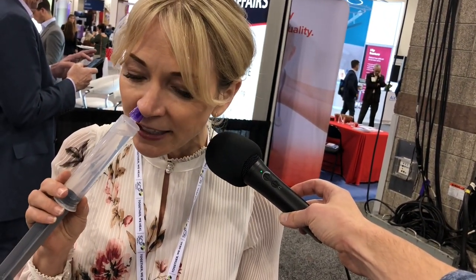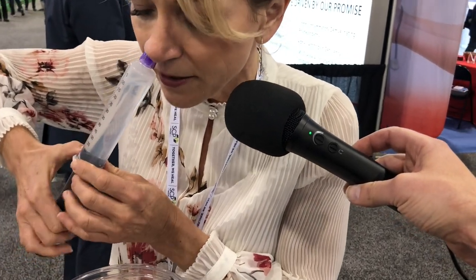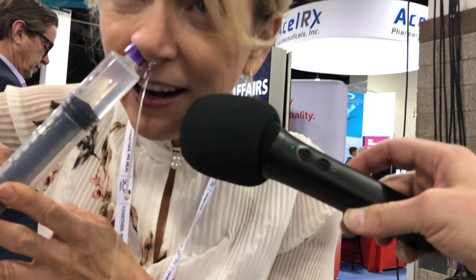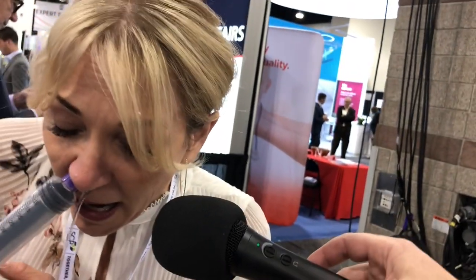The biggest concern people have with using the schnozzle is that they're going to drown a patient. So you're going to first insert the schnozzle — this is for adult patients — into the nose and lean forward. For pediatric patients, you'd turn the head to the side, insert in the upper nostril, and push, and the fluid will come out the other side. You make a really good seal, then push almost as fast as you can, and the fluid comes right out the other side. I'm not choking, I'm not drowning, I'm talking — and there you go.